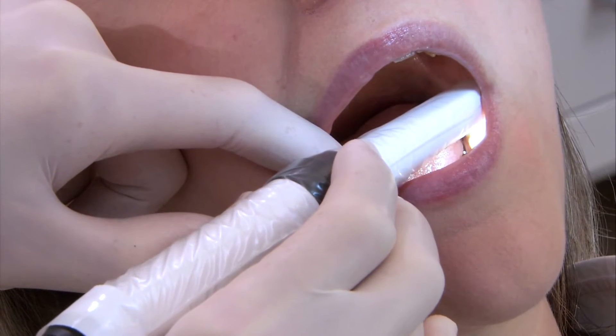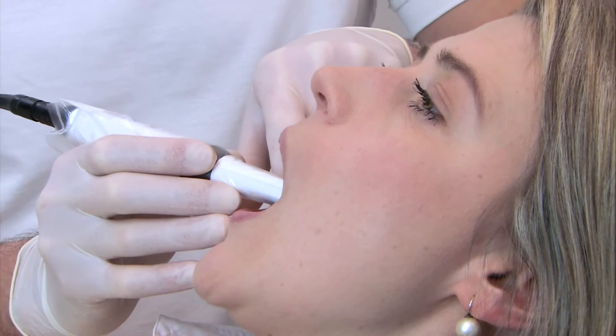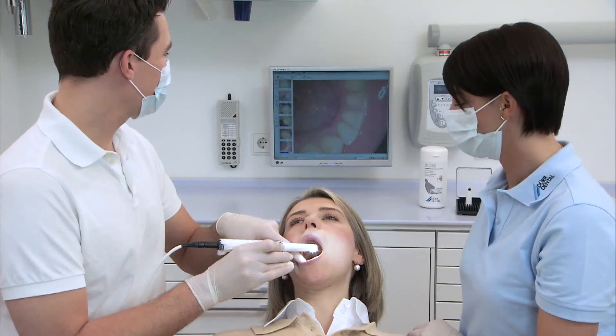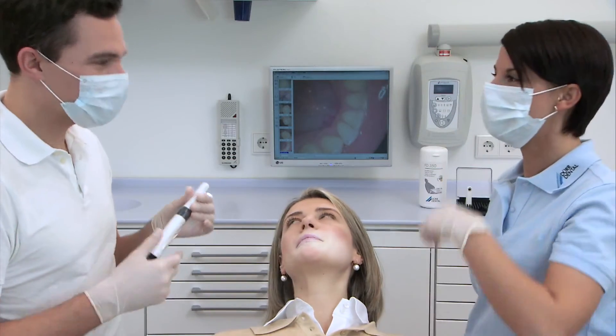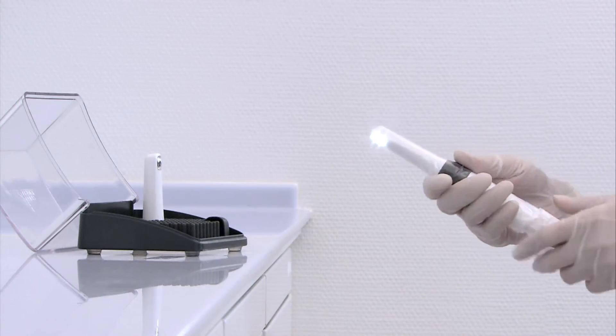Great quality images without blurring can be produced and video clips can be recorded with superior image quality. The sensitive control function registers that the manual trigger has been activated by causing the camera handpiece to vibrate slightly. Even video clips can be recorded in combination with DBS WIN.